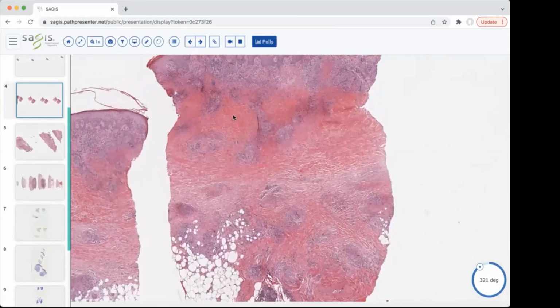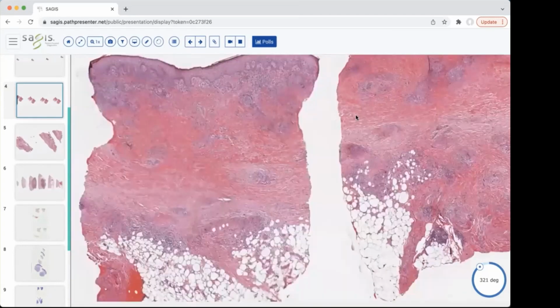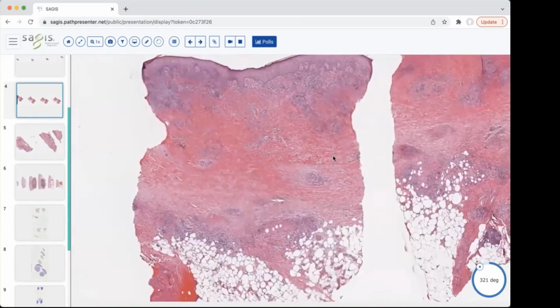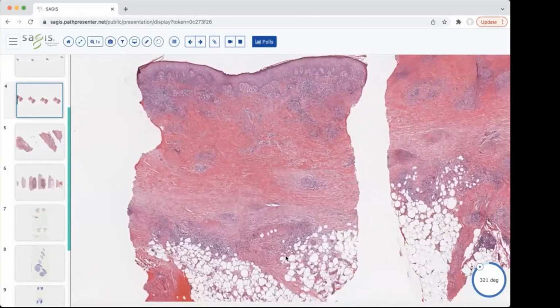The deposits are what they call layered or tiered. So you could draw a line here for this top one, maybe another one here, maybe another one here. And we'll look at a different cut as well to maybe appreciate that a little bit better. Some examples have better tiering and better layering than others. But I think you can appreciate the paleness to these cells here. So we're going to be in a granulomatous category. You may not want to commit to one of our 5 subtypes just yet, but you could think about it being a palisading granulomatous dermatitis.